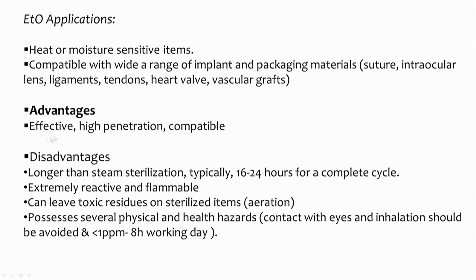So, it is very effective, with high penetration because it is a gas; it penetrates through the interstices and kills. Disadvantage, it takes much longer, 16 to 24 hours, whereas for steam sterilization we are talking about 30 minutes. It is extremely reactive and flammable, so we need to handle it with care. It can leave toxic residues, so we need to aerate completely to remove them. It has a lot of physical and health hazards. Contact with the eyes and inhalation should be avoided by the person doing this type of sterilization.